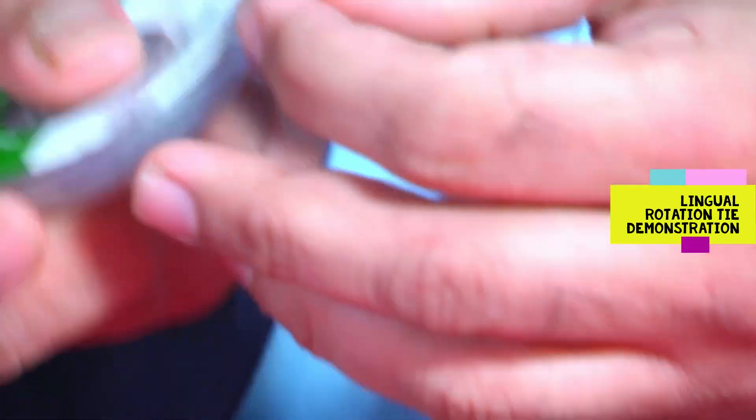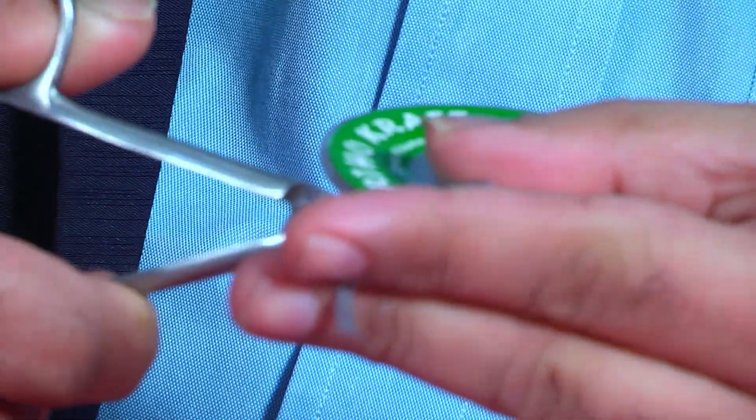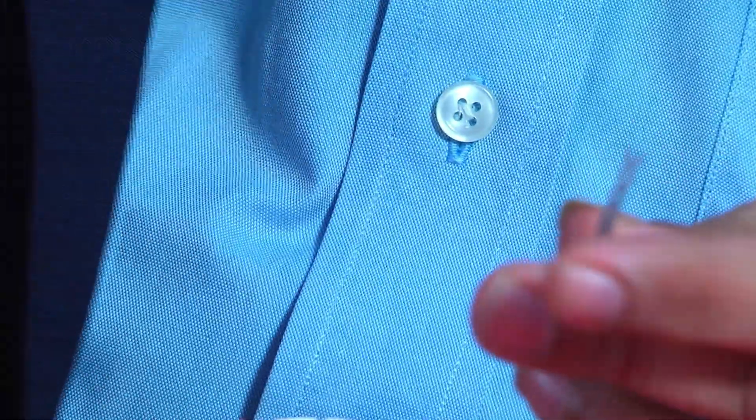This is the power chain — you can use any power chain, it does not matter. Use the scissors to take a piece of the power chain.